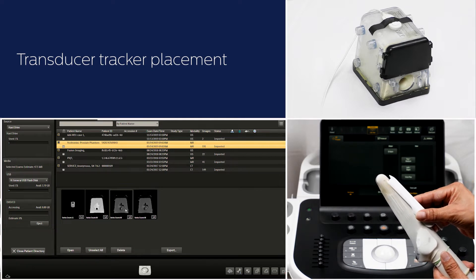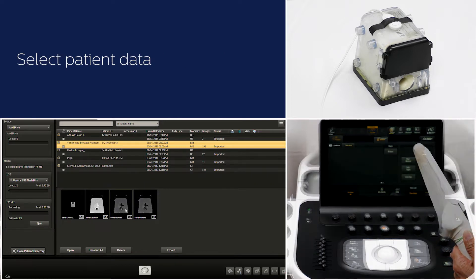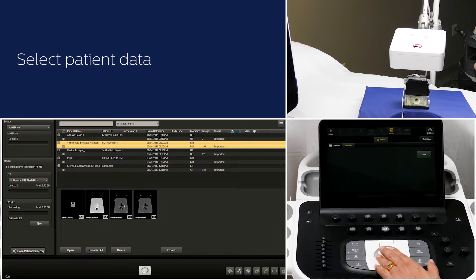Cover the transducer and then place the biopsy guide. Position the field generator to the appropriate position for the procedure. Select the MR data from review and then select fusion.